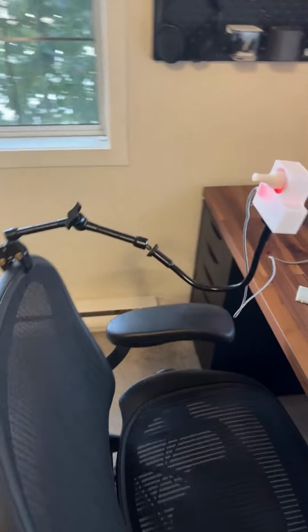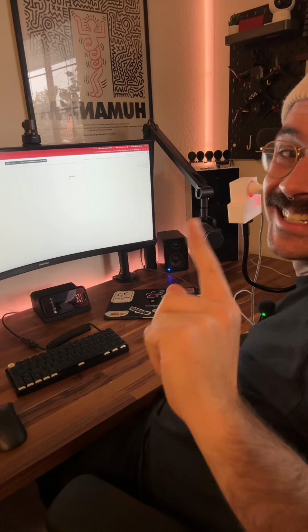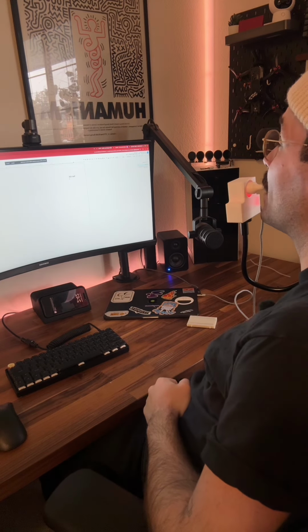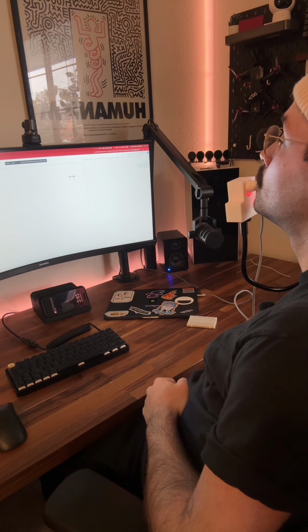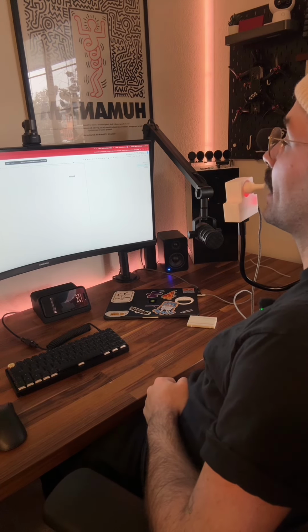And then this is the final setup. I've got this camera arm here that's just used for mounting camera gear, super cheap. The mouse here, my chair, let's see if it works. And just like that, using just my mouth, I can move the mouse, click to select things, right click to copy, and even paste.